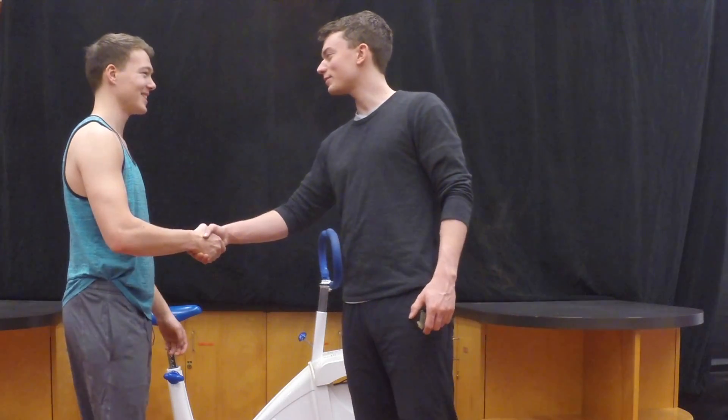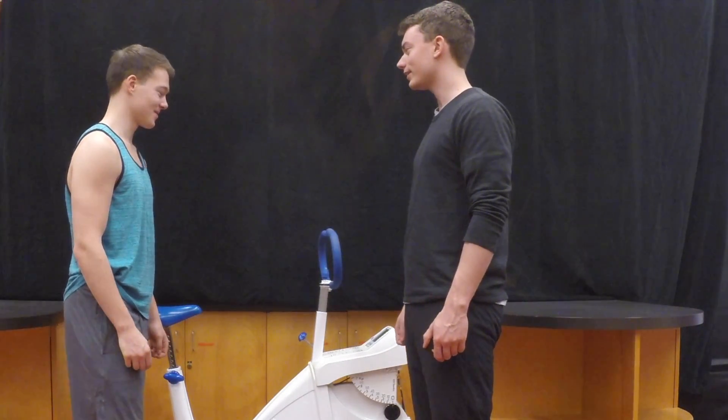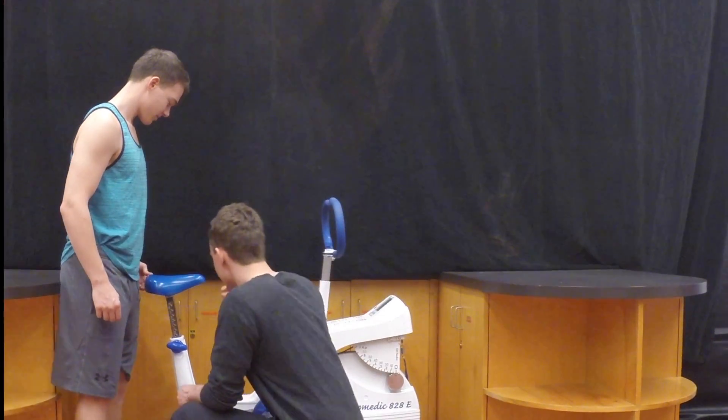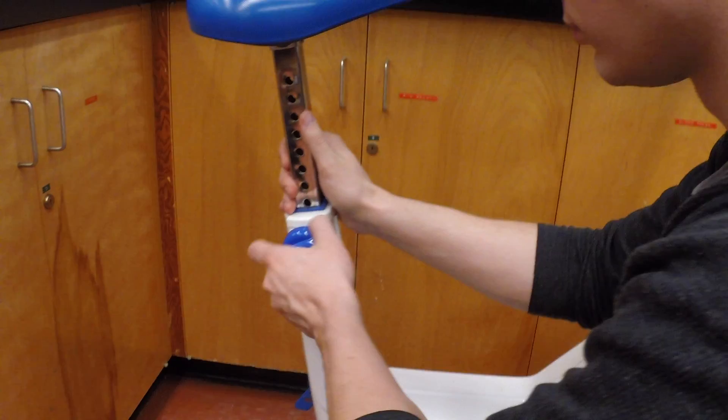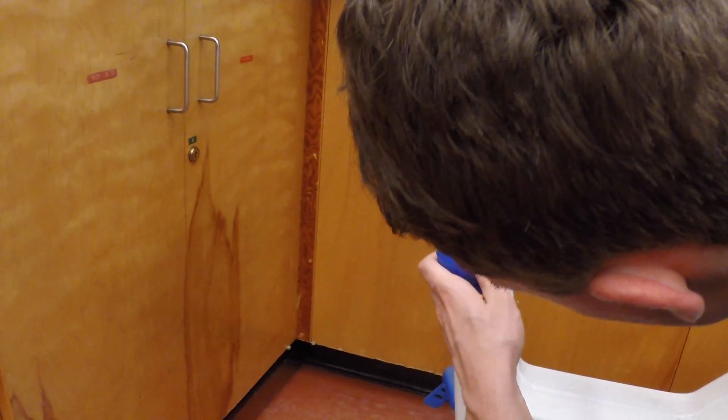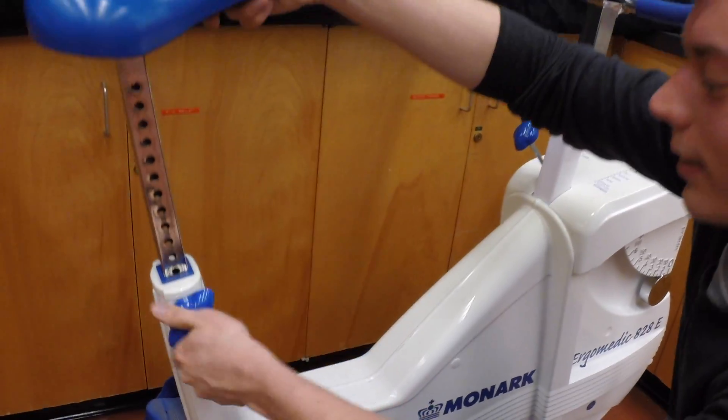To do the Astrand cycle ergometer test, first adjust the seat post to the client's height. Placing the seat at hip height is usually a good start, but further adjustments might be necessary. You don't want them to be rocking side to side in their seat, and you want a slight bend in their knee when they're at full pedal extension.